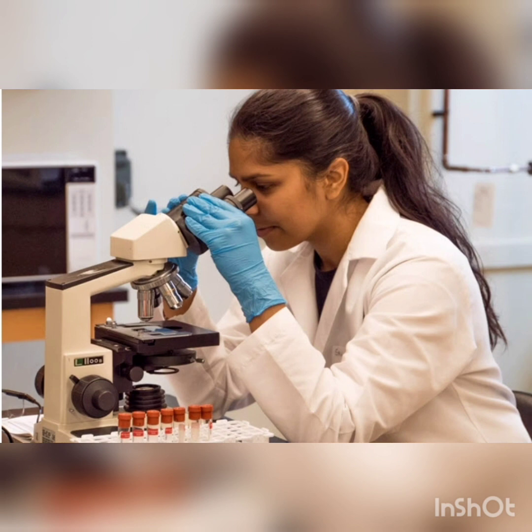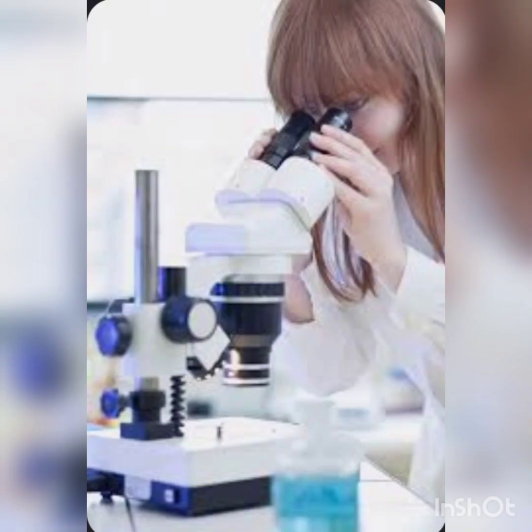Urine specimens for culture can be kept in the fridge for 24 to 48 hours. The organism will not die, which means you can do the study within 24 to 48 hours. And swabs from the wound, urogenital tract, throat, rectum, and feces and sputum can also be kept in a refrigerator for around 24 to 48 hours.